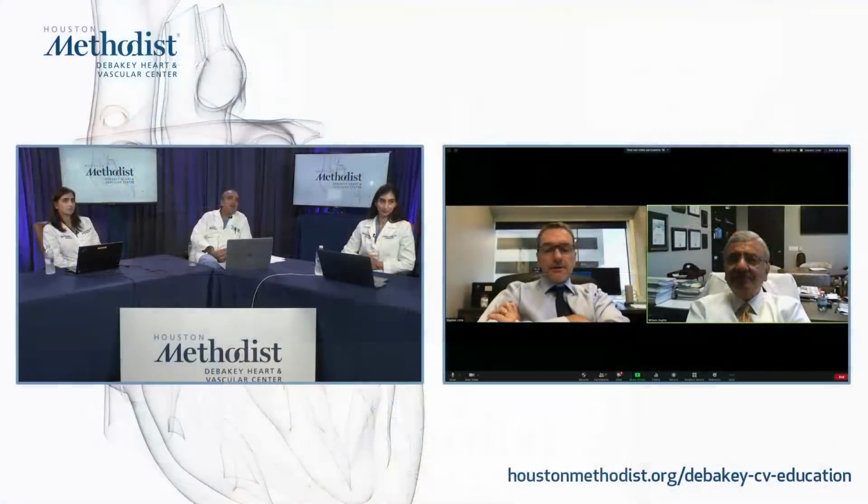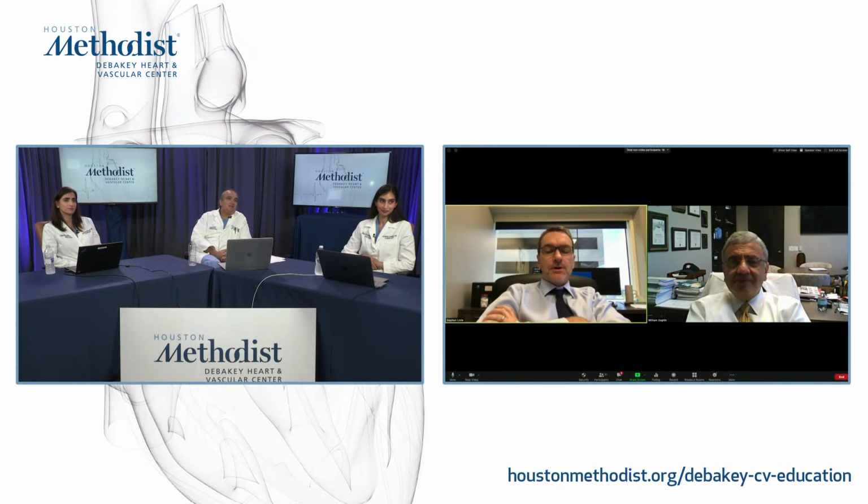I was just going to say that the dogma is see one, do one, teach one. This was a very nice case of do one, teach one. We didn't get to see one first. So the remote teleproctoring worked out really very well, and all of us learned on the job in this case. It was confusing to try to understand what we were planning to do, but this was a very nice fusion of echo and fluoro being used side by side with some CT for planning. Unfortunately, no PET in this case, but the other modalities were very critical. So it was a great case.